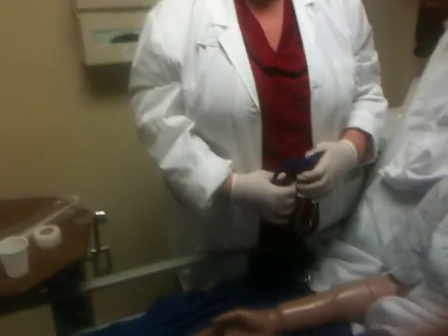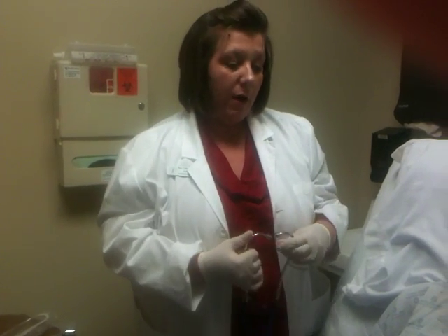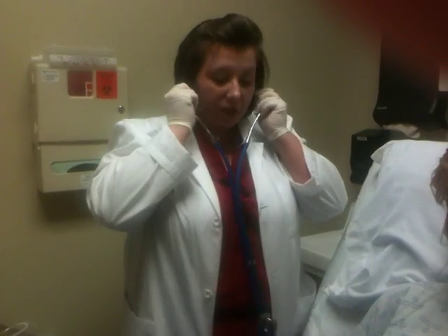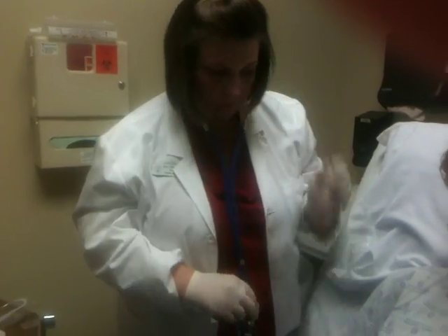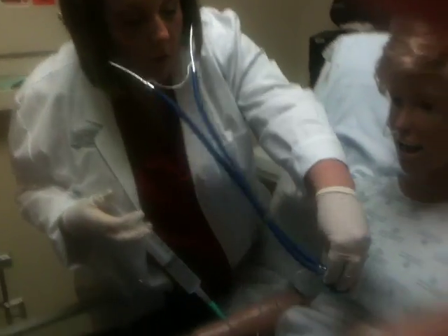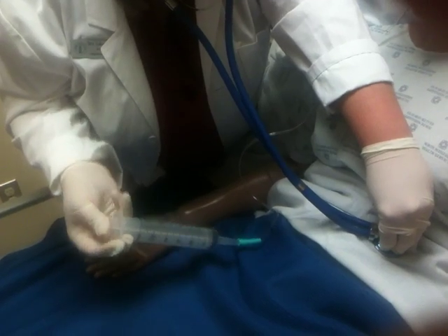Like I told you guys in lecture, the textbook doesn't really recommend the air bolus anymore because they say it's not real reliable, but you will see it in practice. So I will go ahead and show you how to do that. You would take your stethoscope. You have your 30 cc's of air. You would listen over the stomach, inject your air. You should be able to hear it in the stomach.